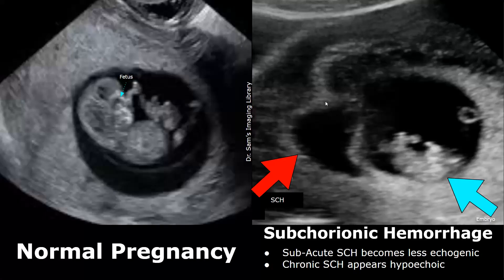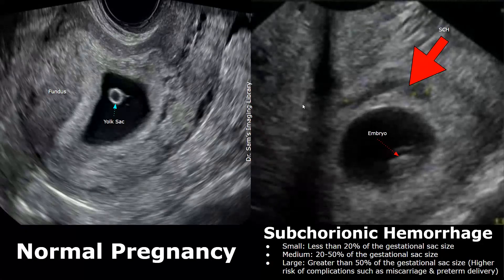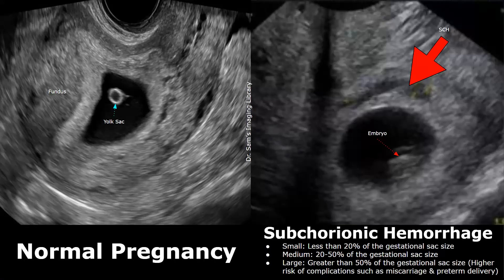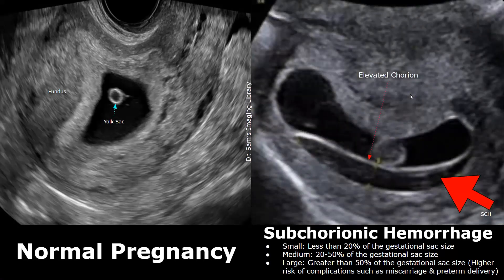This is a large hematoma. Subchorionic hemorrhage can be classified as small, medium, and large. Its size is compared with the gestational sac size. A small hemorrhage is less than 20% of the gestational sac size. A medium-sized hemorrhage will be 20–50% of the gestational sac size. A large hemorrhage will be greater than 50% of the gestational sac size, and carries a higher risk of complications such as a miscarriage or preterm delivery.